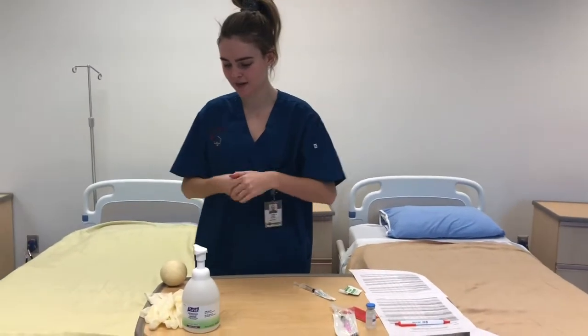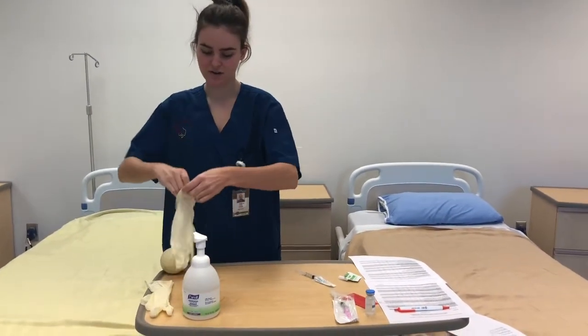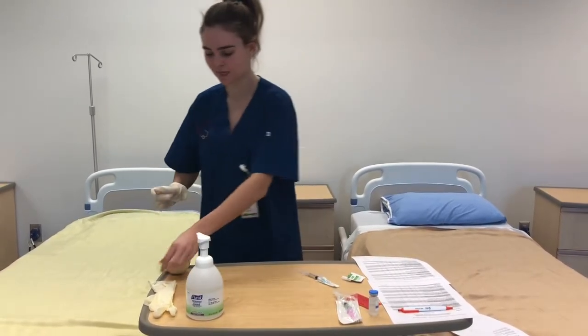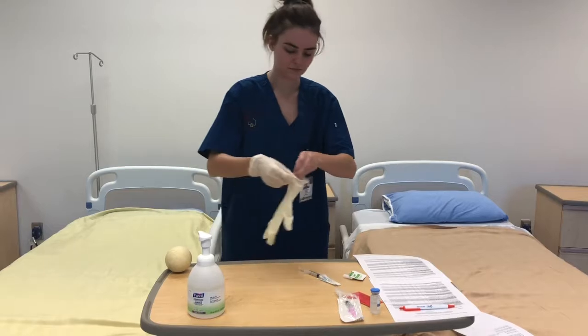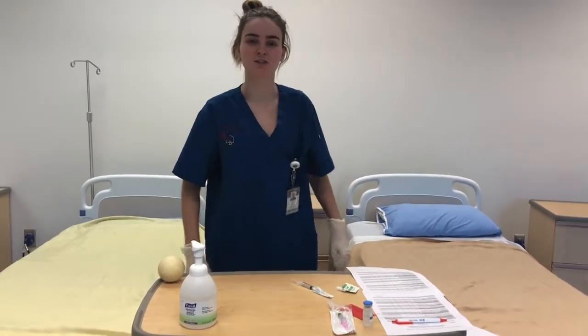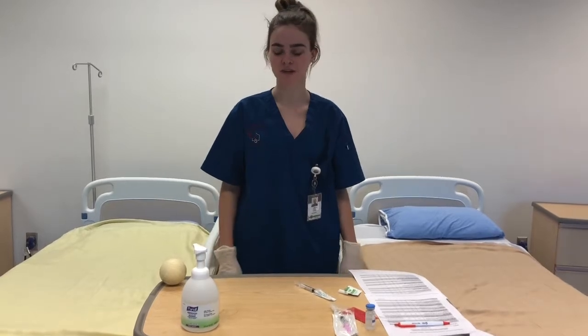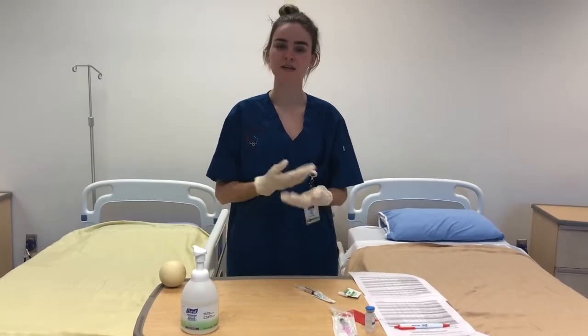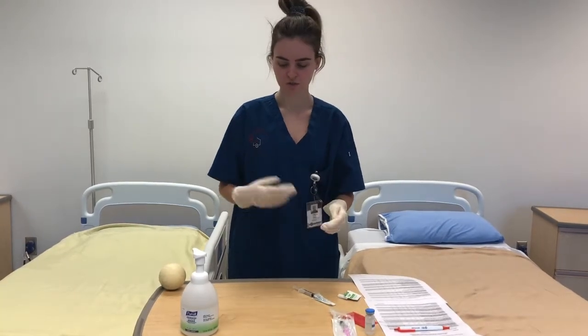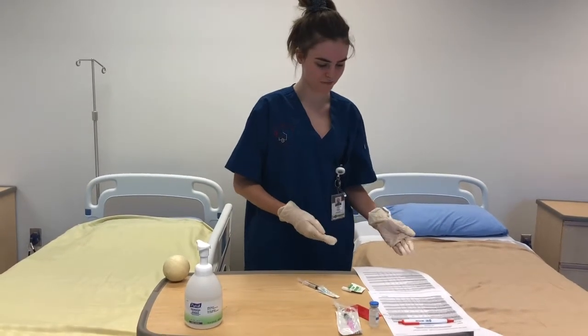So I will be performing hand hygiene and donning on the gloves for when I touch my patient. So before doing the injection, I'm going to use my patient identification. So I'll be asking Mr. Mancini his name and his ID badge for the hospital number to ensure that it correlates with my MAR.